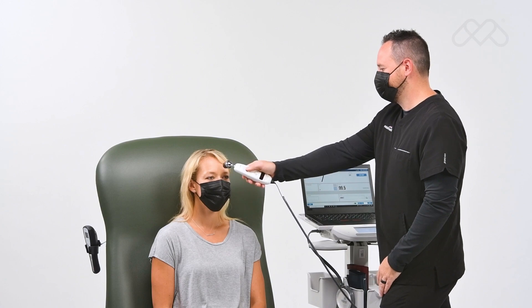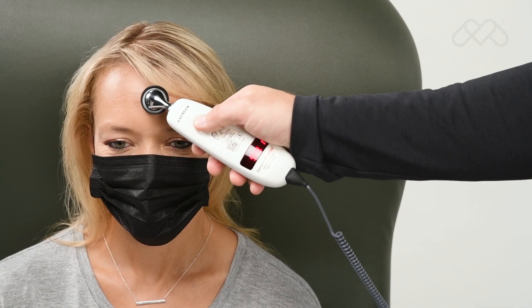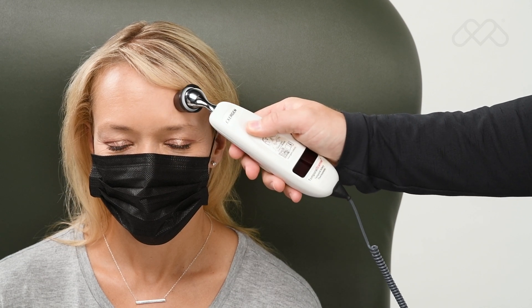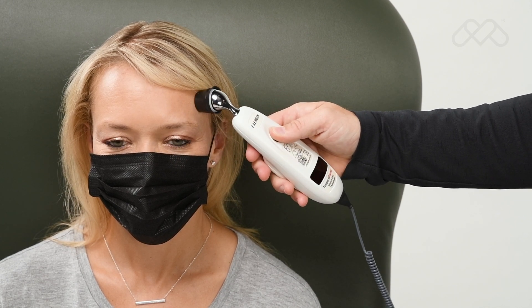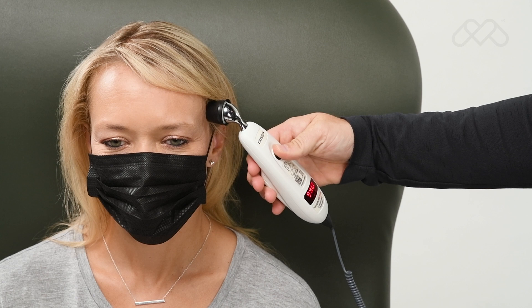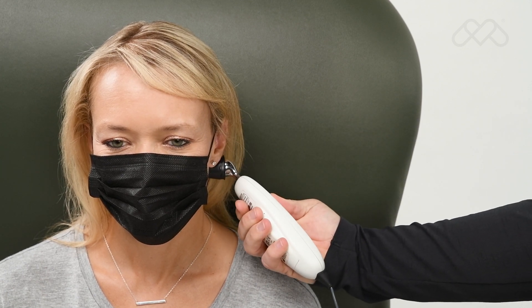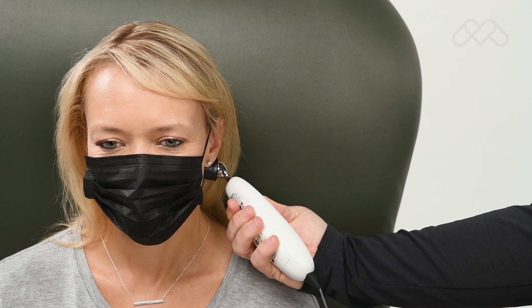Place the probe flush on the center of the forehead and depress the button. Keeping the button depressed, slowly slide the probe midline across the forehead to the hairline. With the button still depressed, lift the probe from the forehead, touch the soft depression behind the earlobe, release the button, remove from the head, and read.